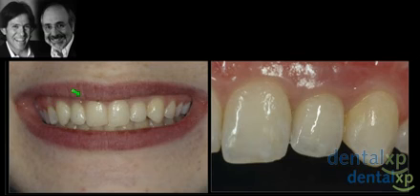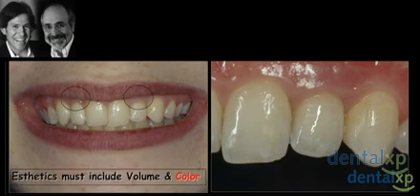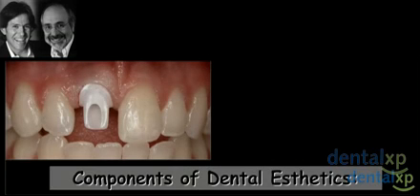This is about 2 years post-op. A high lip line case. You can see the color, very difficult to discern these two spinel all-ceramic crowns from the adjacent natural teeth. And you can see that this tissue, this dense fibrous tissue, can be maintained over the long haul. So obviously just another option for how to rectify color issues. I think tissue thickness is something that is often neglected in diagnosis, and at least for us, something that we really point out to the patients, at least in the aesthetic zone, is very important.